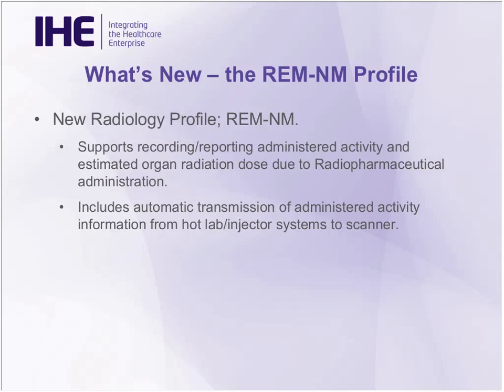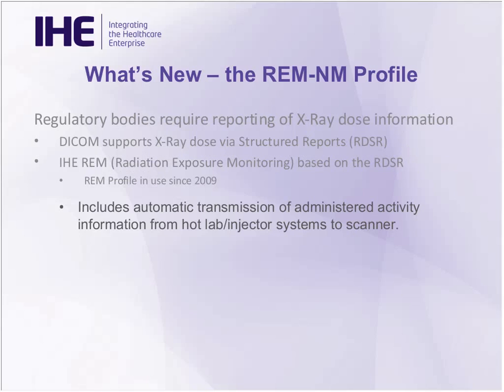This has traditionally been a problem spot for nuclear medicine. It involves a lot of manual transfer on paper or whatever from the hot lab to the scanner that's actually doing the imaging. So this is a nice benefit of this profile, is that it can automate that procedure, eliminating a lot of the transcription mistakes that happen today.